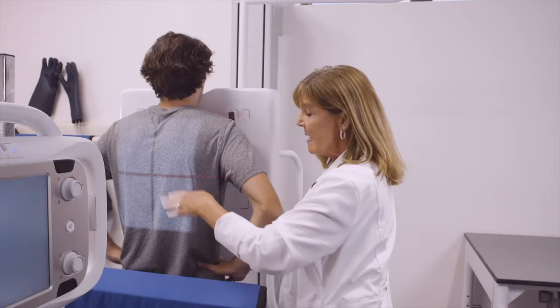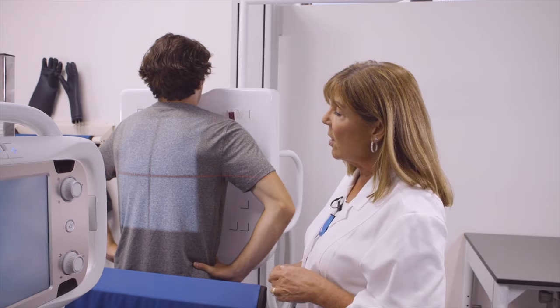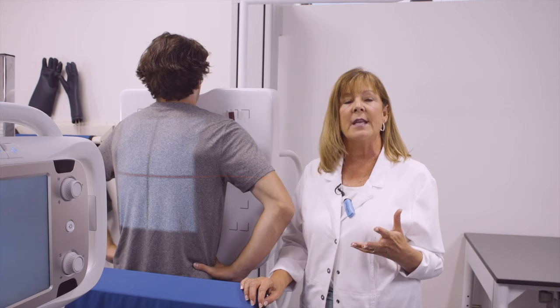His hands are on his hips and we're going to roll those shoulders and elbows forward. That is in efforts to pull the scapula more lateral so we can visualize more of the lung field. This will be taken on inspiration — the second inspiration — and this is essential so that the lungs are fully inflated and we can see about 10 ribs on a PA chest.